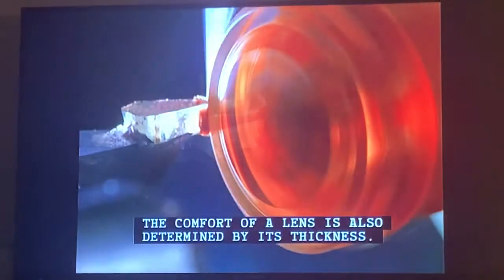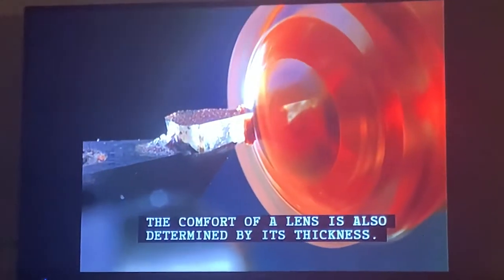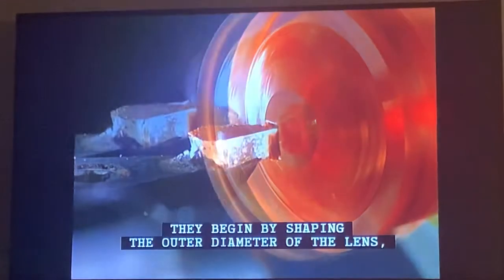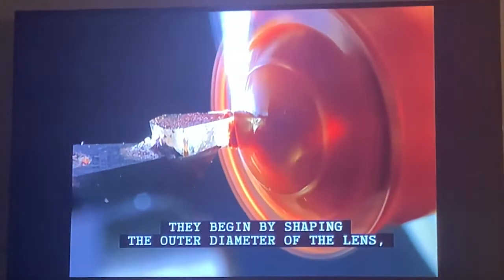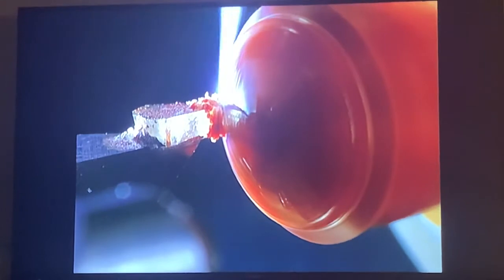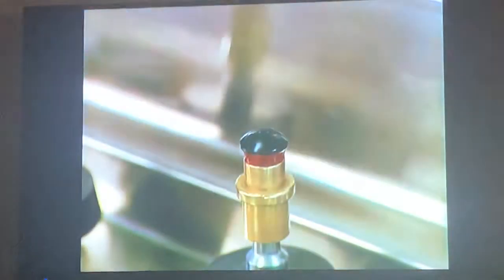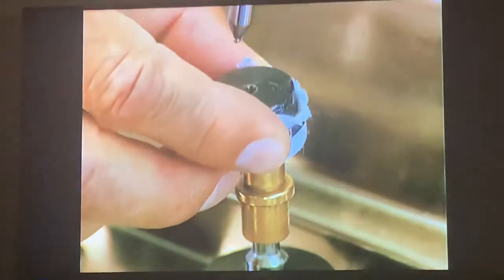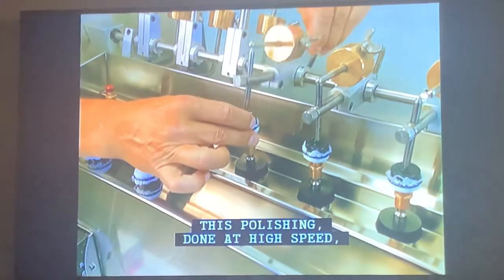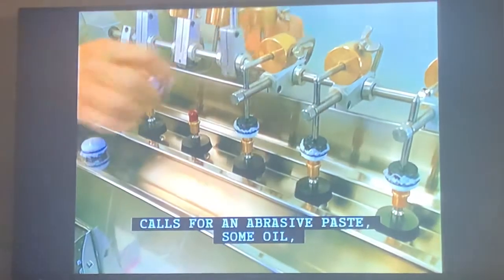The comfort of the lens is also determined by its thickness — it must be as thin as possible while retaining sufficient solidity. They begin by shaping the outer diameter of the lens, which takes only a few seconds. They now polish the outer surface of the lens, a process done at high speed that calls for an abrasive paste.